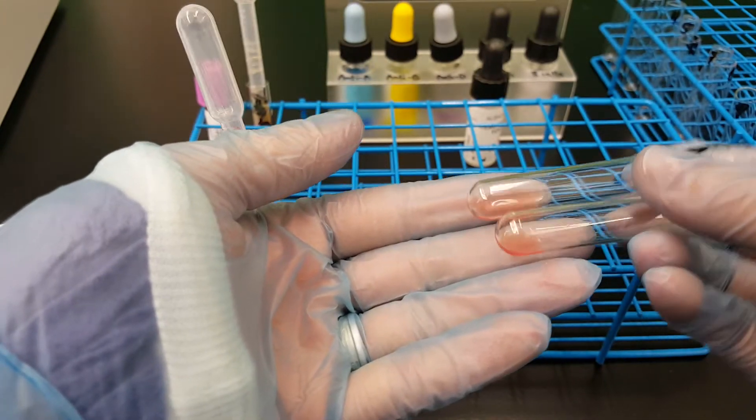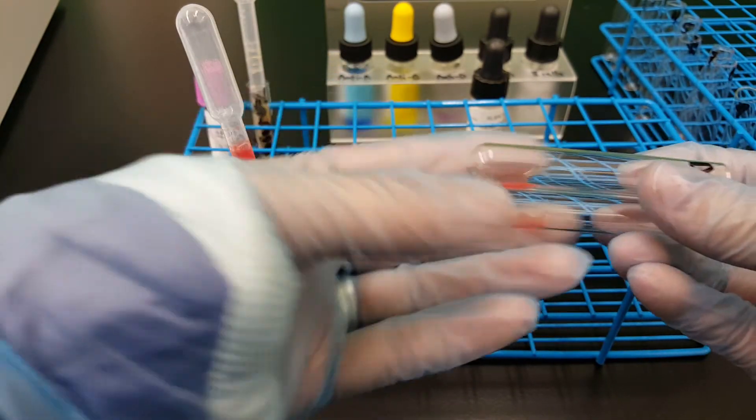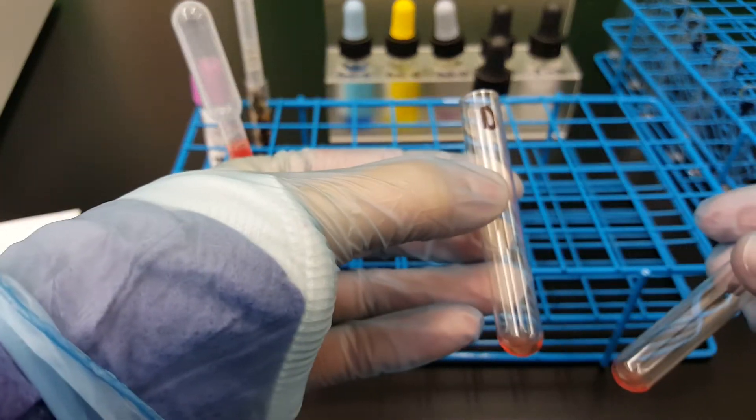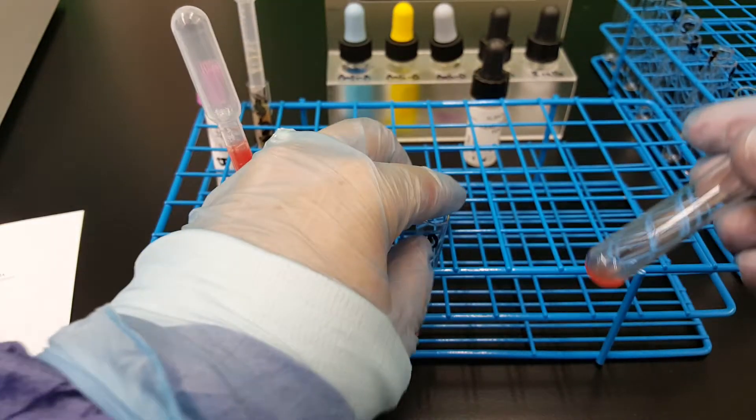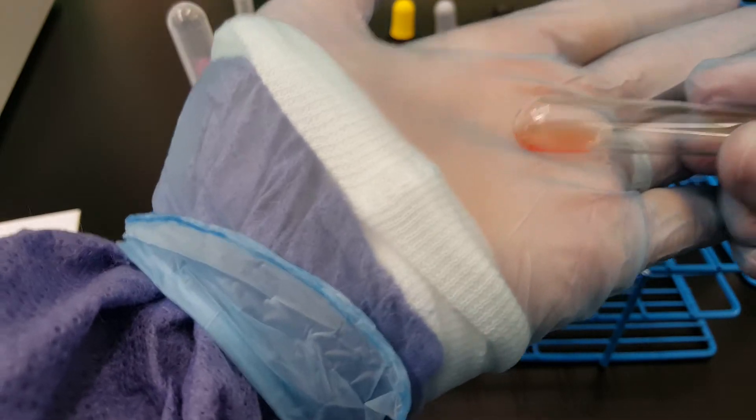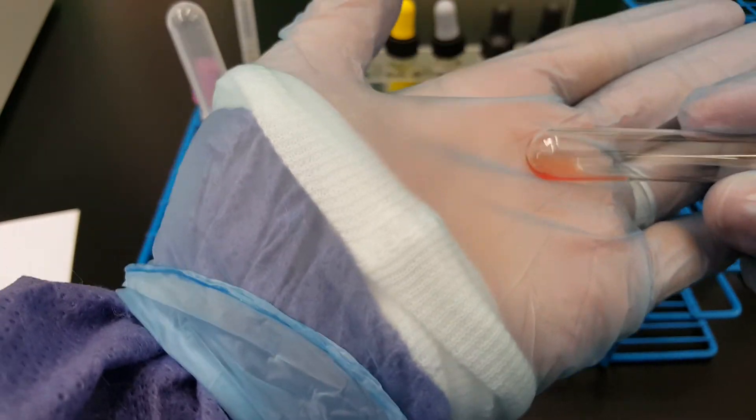So just like we saw before when we did the ABO, the D is considered negative, the anti-D is considered negative. There aren't any agglutinates in there and same with the D control.